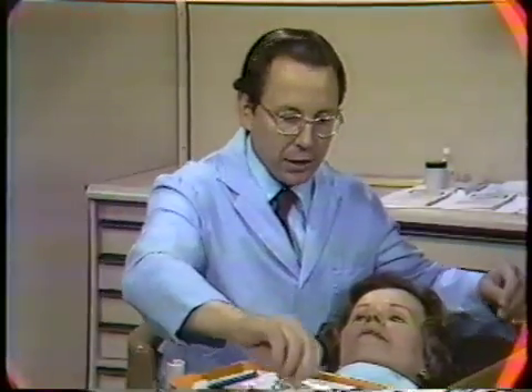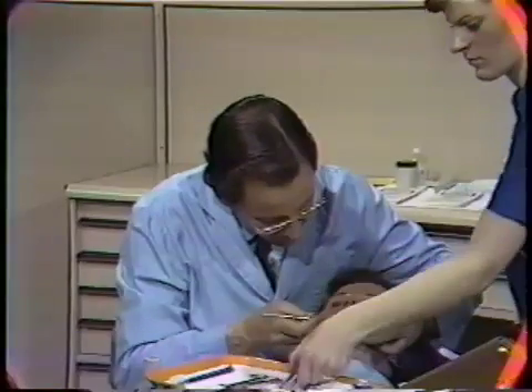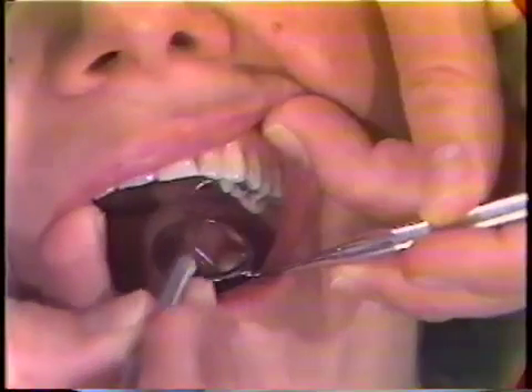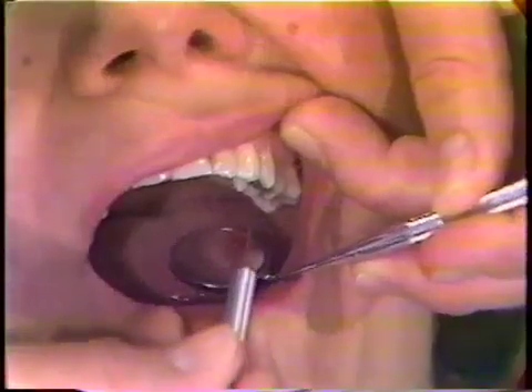I'll double-check the area with the explorer to make sure that everything is coming along satisfactorily, and also to make sure that the soft debris is removed from around those teeth interproximally. I'll also check to make sure that I removed all the dressing material from the crowns of the teeth, any that might adhere.